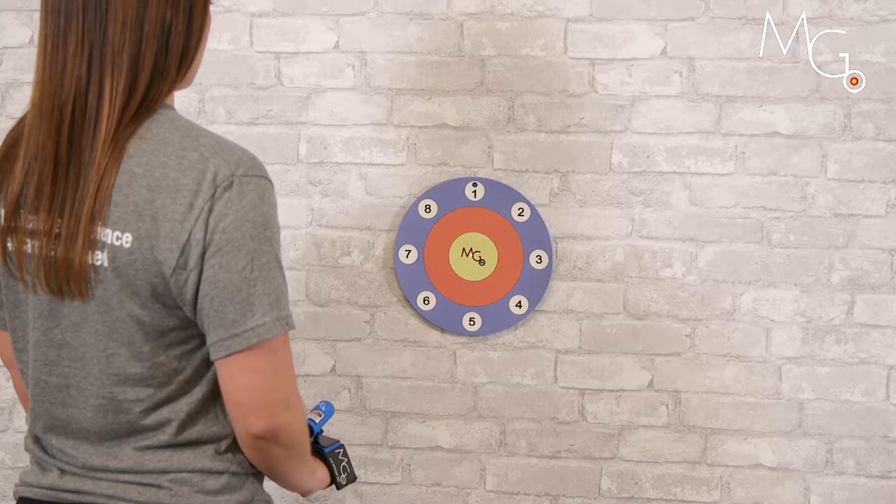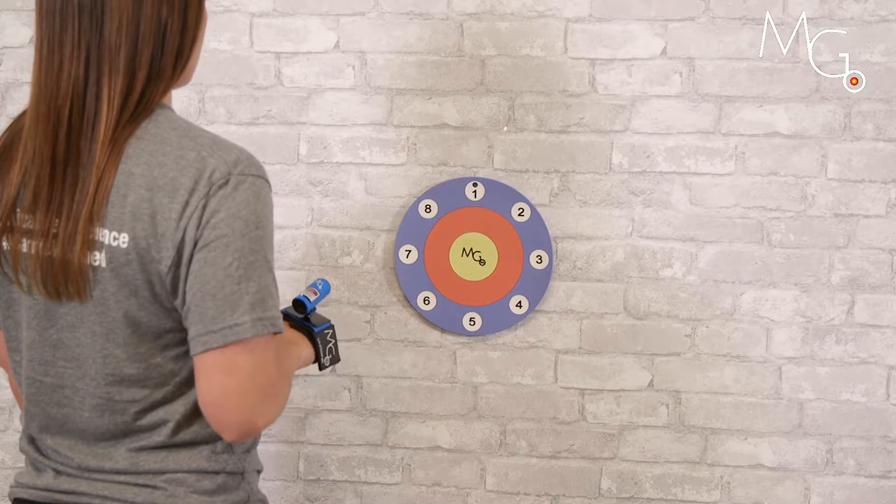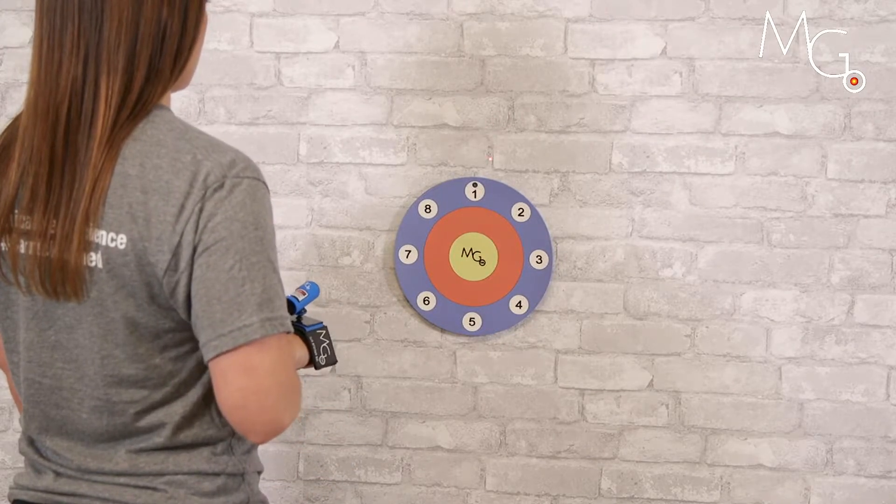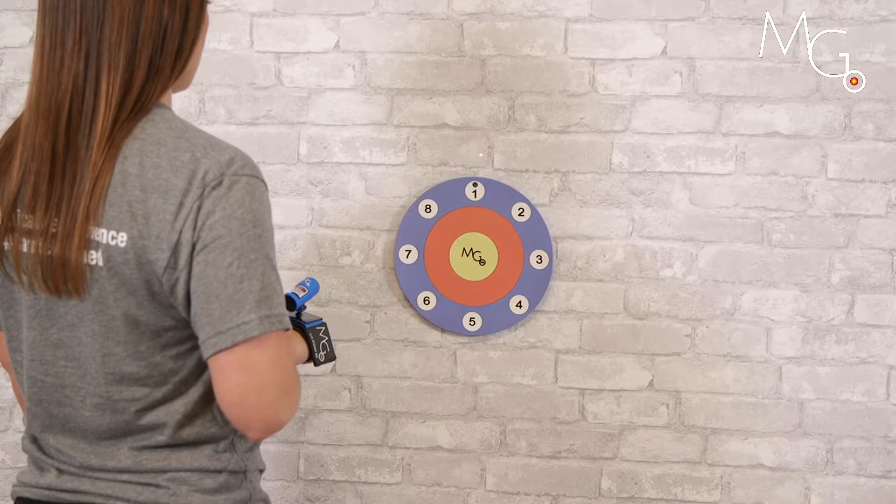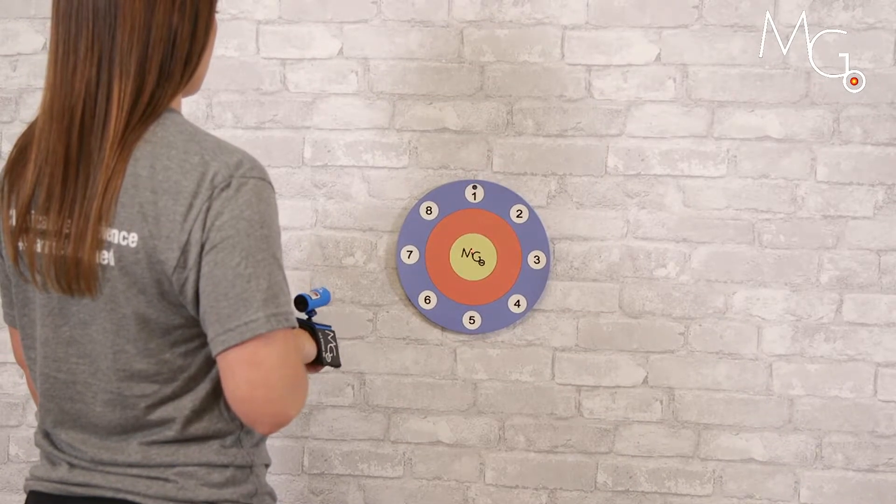Now let's work on wrist flexion. So let's have you bend your elbow up a little bit, bring the laser above the target, and now drop the laser down to the bullseye.